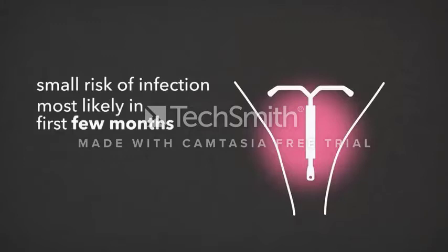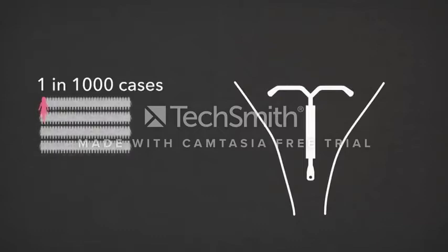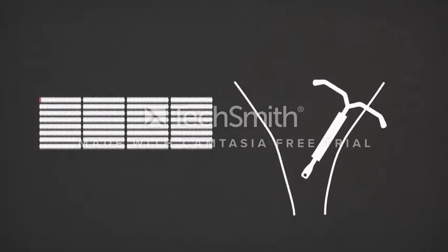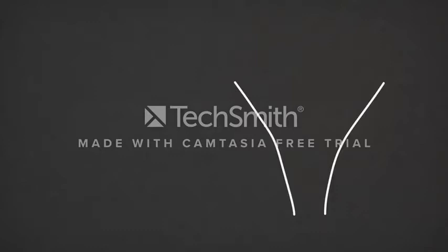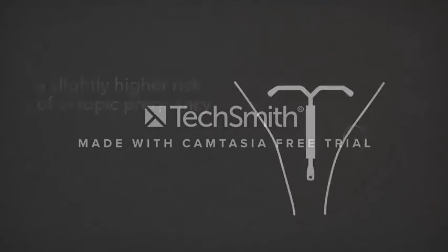having the device fitted. In 1 in 1,000 cases, the IUD or Mirena can go through the wall of the womb. If this happens, you may need a small operation to remove the device. You are overall less likely to fall pregnant with an IUD or Mirena, but if you did, then there is a slightly higher risk of it being a pregnancy outside the womb, which is called an ectopic pregnancy.